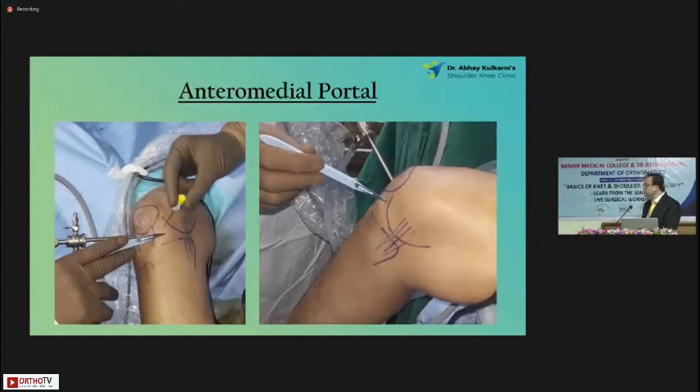Now we come to the anteromedial portal. The anteromedial portal should be made by viewing the knee from the anterolateral portal. You have to see where you want to actually make the portal — it will differ. If I'm doing a posterior horn meniscus repair, it will be an inferior portal. But if I'm doing an ACL, it will be slightly higher and medial. This has to be quite flexible, according to the needs of the surgery. And another important point — look at the scalpel: the cutting edge is pointing upwards because this will prevent any damage to the meniscus. If it is the other way around, you might injure the anterior horn of the meniscus. It's a very important point — please keep that in mind.